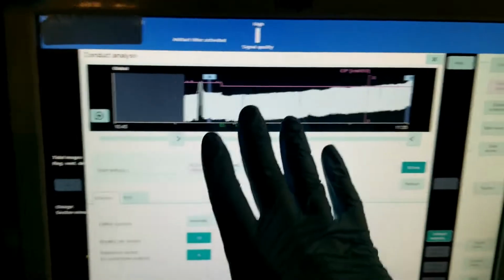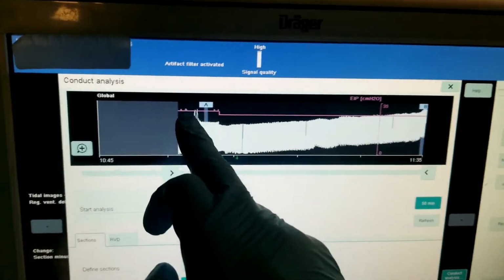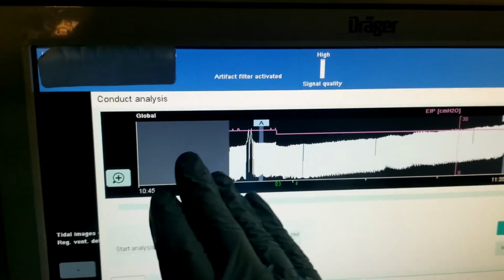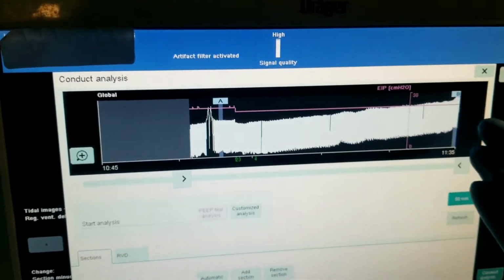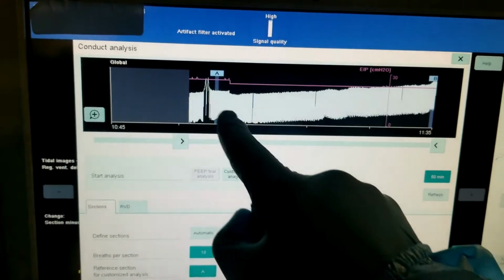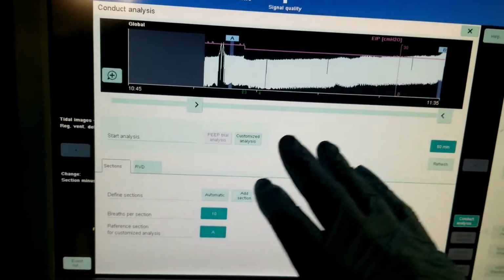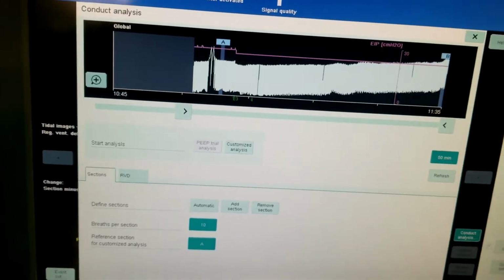And finally, a third way of verifying and guiding us using APRV here is, again, up here, we see that 26 drops over here to 24. Again, it's also showing the impedance values, and you see underneath this dark area that's increasing is representative of your functional residual capacity increasing. So when you look from here to over here, we could also do this customized analysis and look at, is the compliance from here to here better, worse, no change?